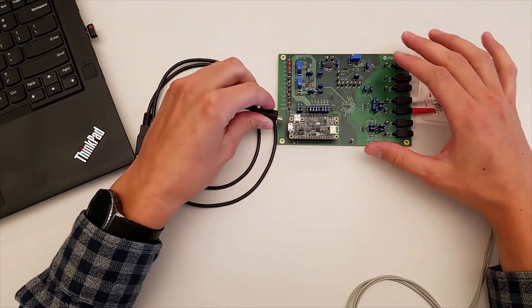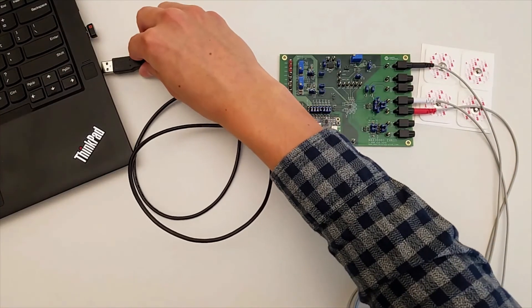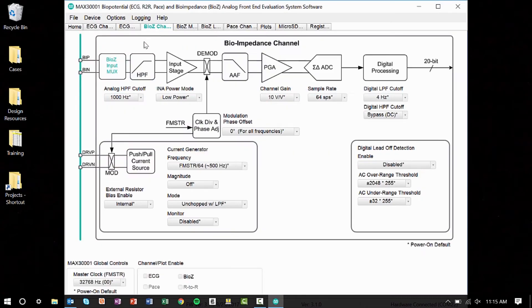Lastly, connect the micro USB cable to the microcontroller on board and to your PC. Open the GUI and head to the BioZ channel tab, which visually sets the control registers.